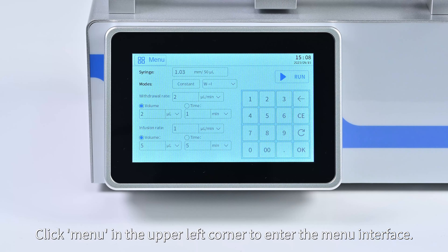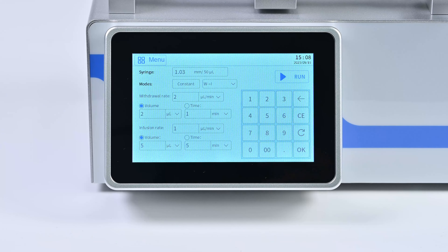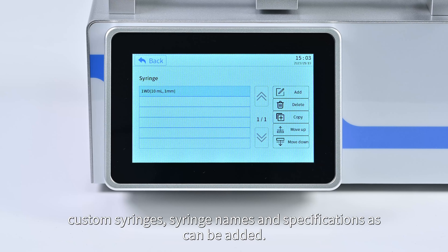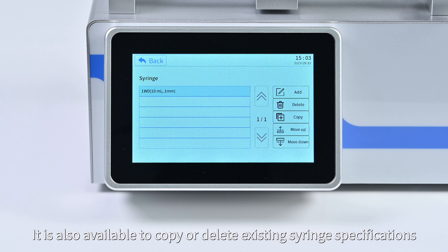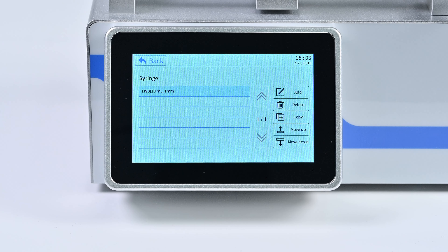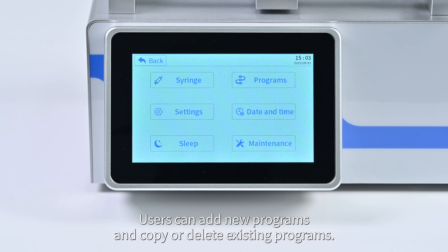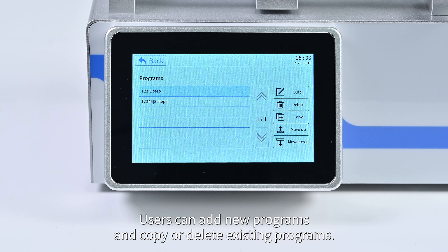Click 'Menu' in the upper left corner to enter the menu interface. The syringe management interface allows users to manage custom syringes — syringe names and specifications can be added, copied, or deleted. In the program management screen, custom programs can be managed; users can add new programs and copy or delete existing programs.